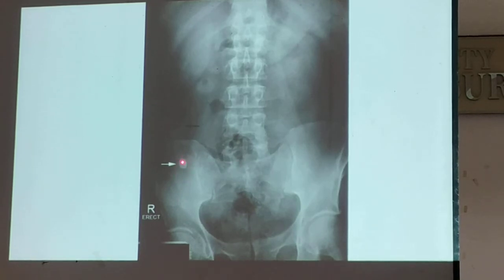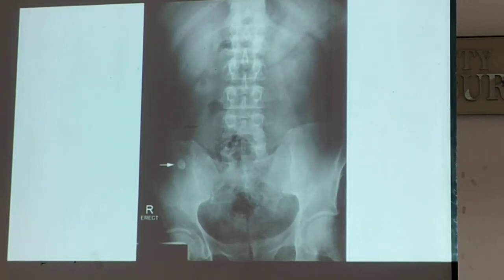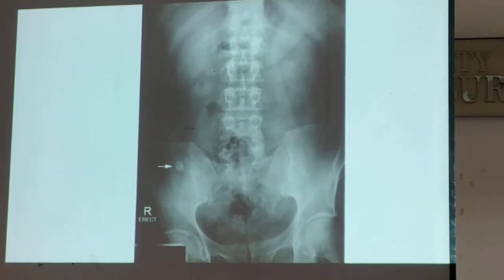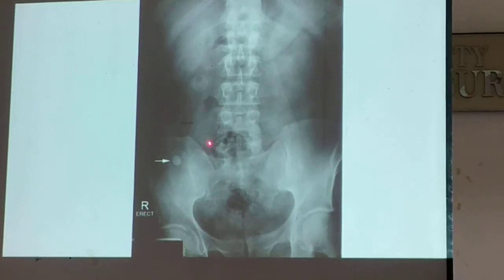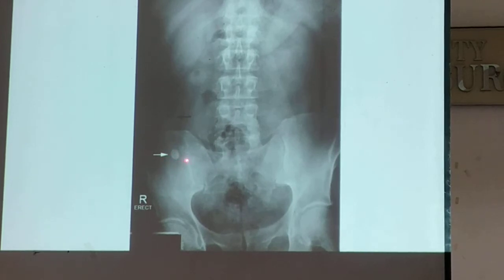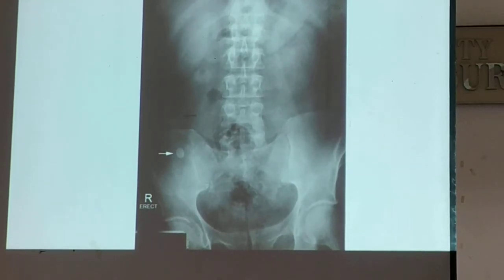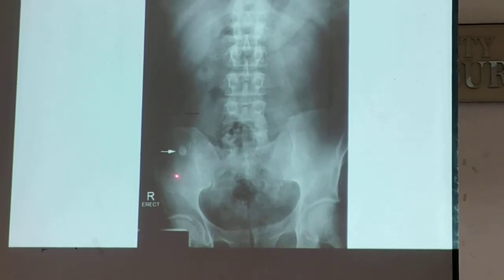The lesion is this one. Normally you do not see this — try to compare the right side and the left side. If you see this solitary calcification, this would be considered an appendicolith — a stone in the appendix. Your ureter is seen at the lateral side of your spine, so you should not consider this a ureteral stone. This is in the right lower quadrant area.